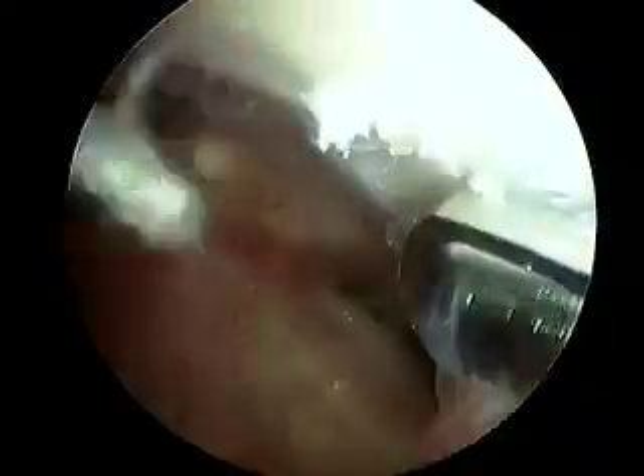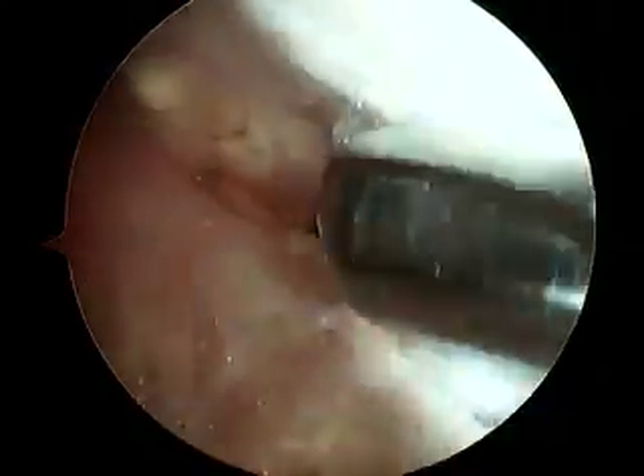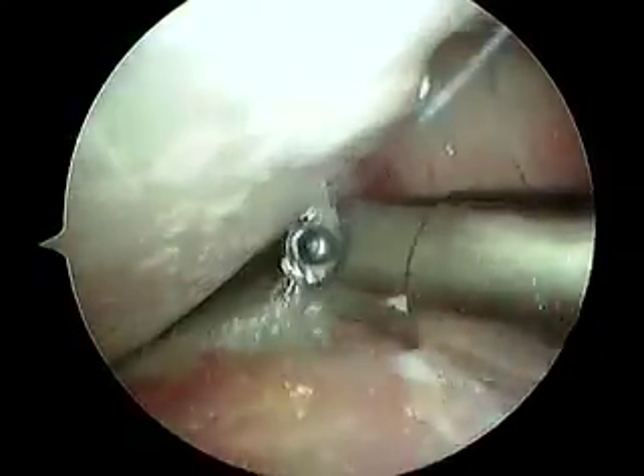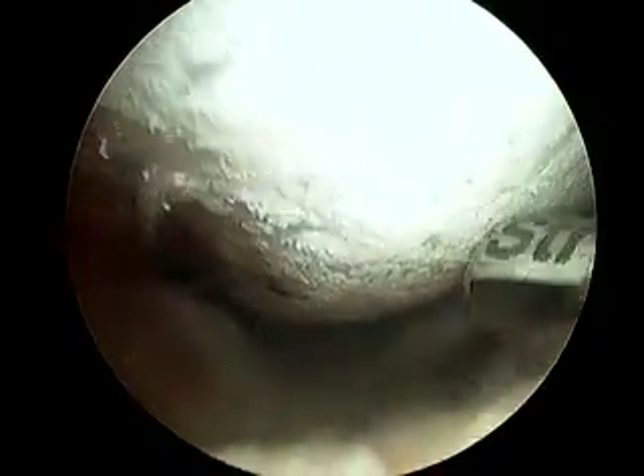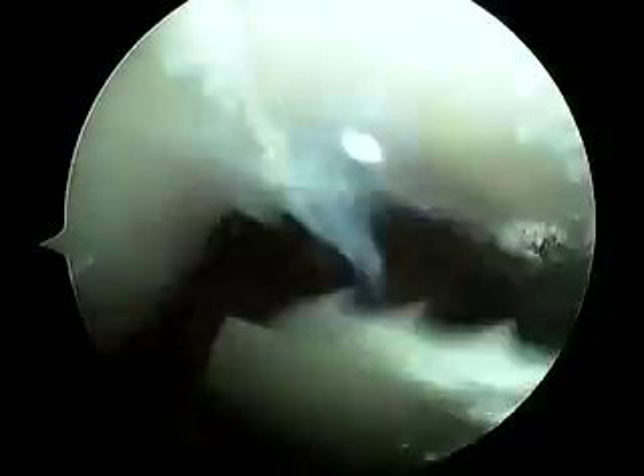You need to see an arthritis specialist probably and get on some good treatment for this problem. We're going to keep looking around and see if there's anything else we can do. If we get rid of some of this red swollen tissue, I think it's bound to help your knee feel better, but it won't solve this problem. This problem is a chemical problem in your body, but the medications used to treat it are usually quite effective — they keep that uric acid from building up.